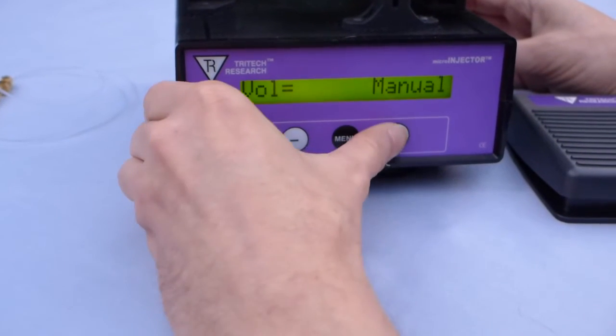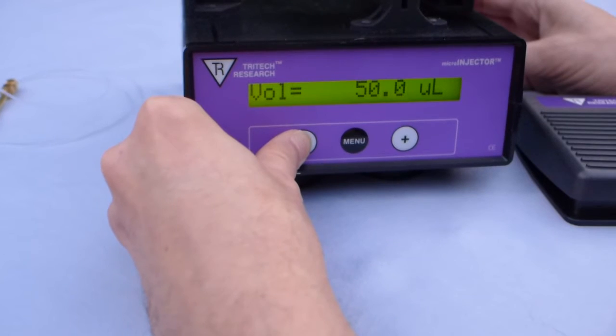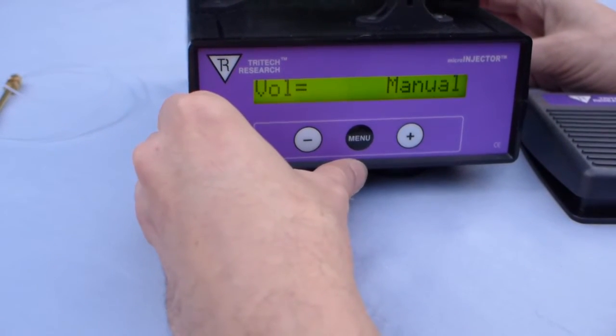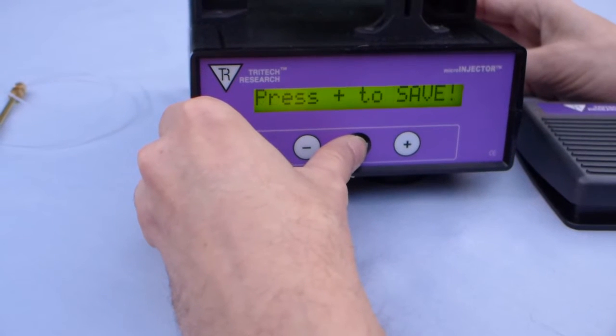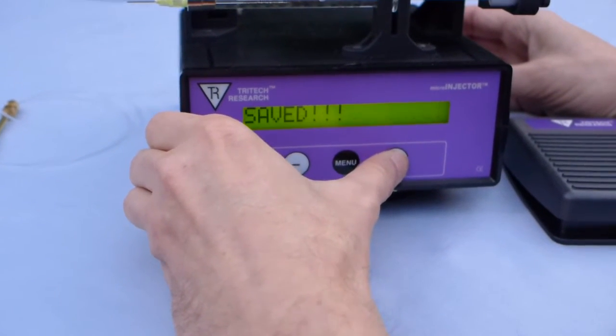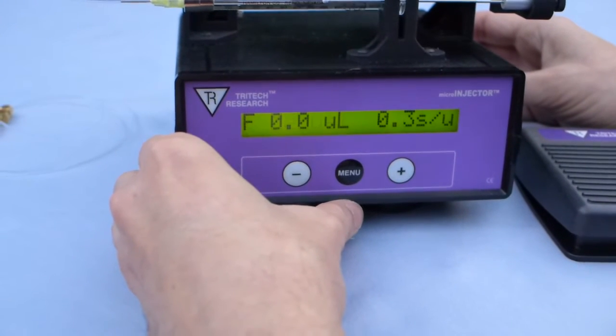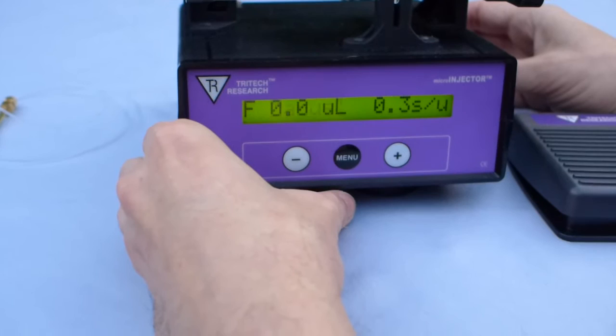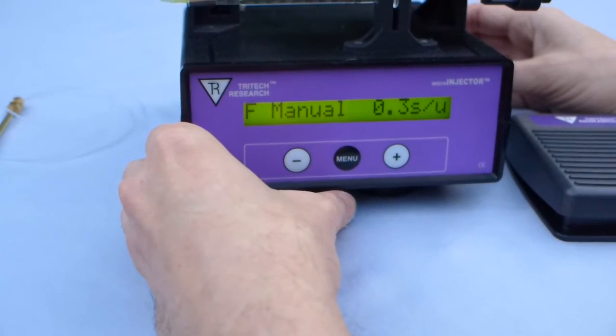And then when you've got the setting that you would like it to be at, what you do is you push the menu button again, and then it says press plus to save. And if you press plus, it saves it, and now that parameter is stored in the system, and it will remember that when power goes off and power comes on.